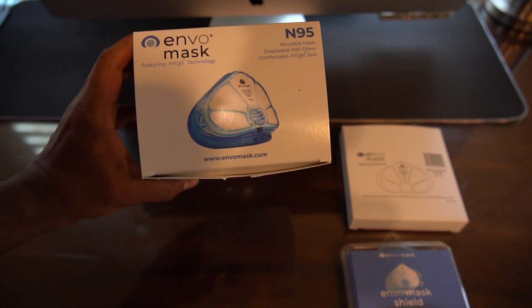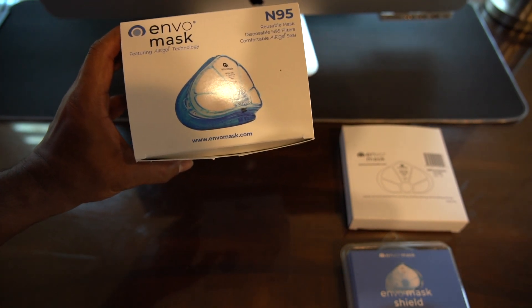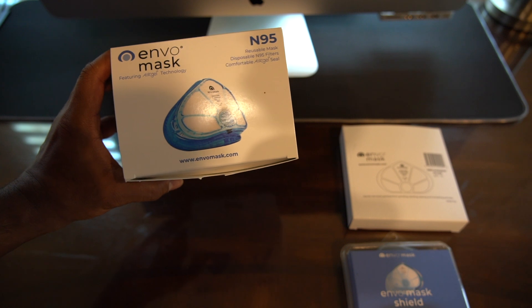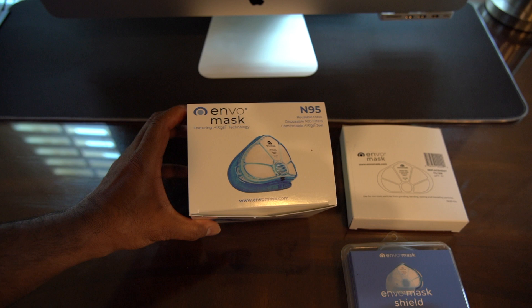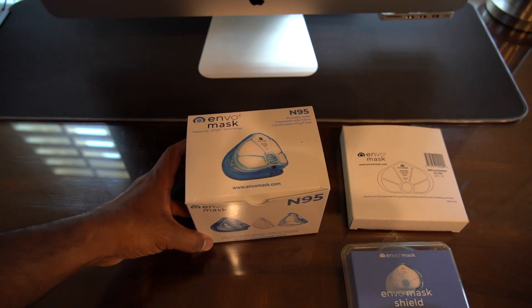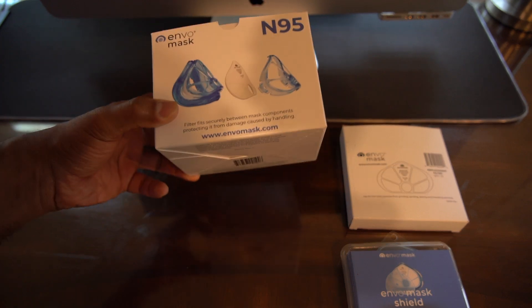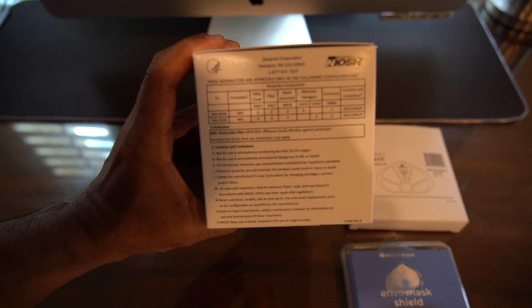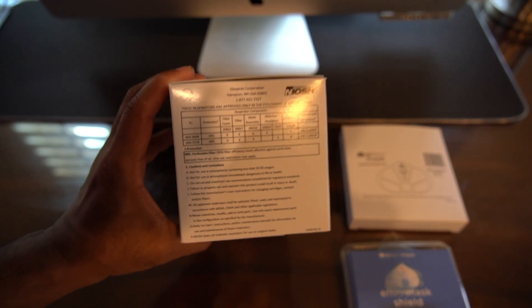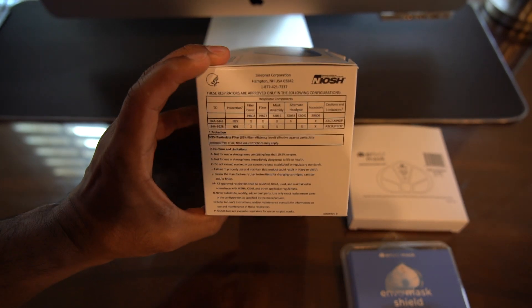I'm making a video about this new Envo mask — an N95 mask featuring air gel technology. I recently bought it and haven't opened the box yet. I've been using the N95 mask provided by the hospital but I just couldn't take it anymore — very uncomfortable, breakouts everywhere on the face, hard to breathe, and they're not easy to come by frequently.